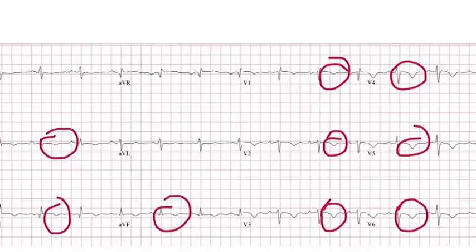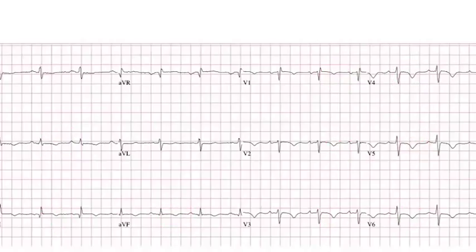It's wrong. T wave inversions are common in a lot of conditions, and maybe one week we'll come up with a list of probably 50 things that can flip your T waves. But in addition to cardiac ischemia, the other major organ system that is notorious for flipping the T's is the pulmonary system, the lungs. Lung problems can cause flipped T waves. Acute lung problems, for example, pulmonary embolism or pneumonia, or even a hyperventilation.